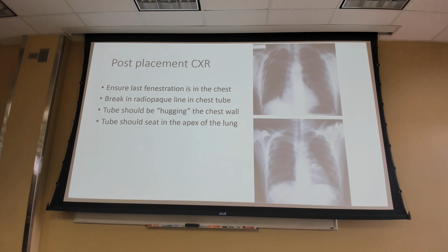Yeah, it's subcutaneous. So I don't know how they got it all the way up there. That would be very painful, obviously, for the patient, so hopefully they were unconscious for this. But basically, they probably didn't do that finger sweep to ensure they were inside the pleural cavity. They made an assumption that they were in the right area, and then they inserted it. I would think there'd be a lot of resistance, but maybe not. Maybe if you hit some fascial line.